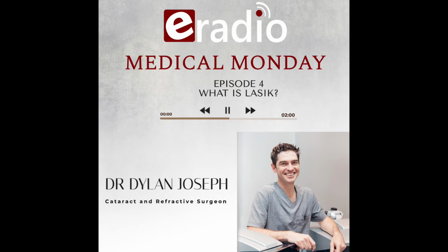It was actually the first form of laser vision correction that was developed. But the interesting thing about PRK is that unlike LASIK, it can be quite uncomfortable for 2 to 3 days after the procedure, although the medication that we prescribe to you afterwards often helps dull that discomfort quite significantly.